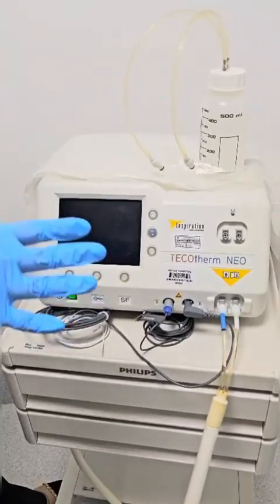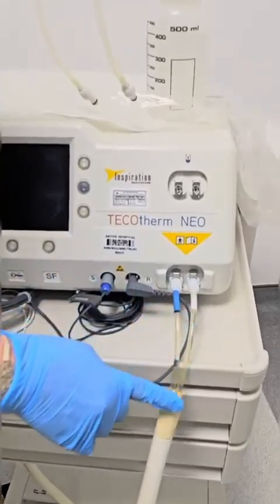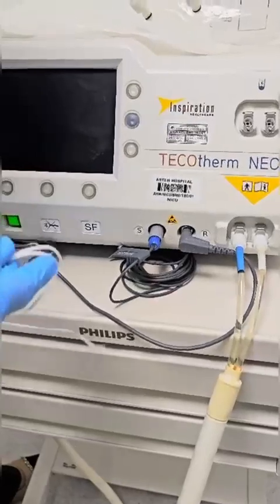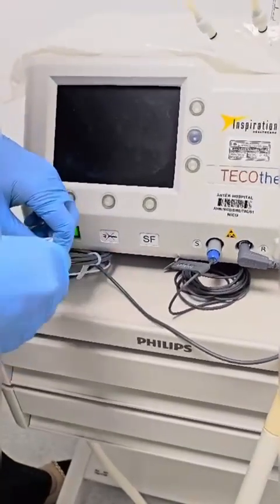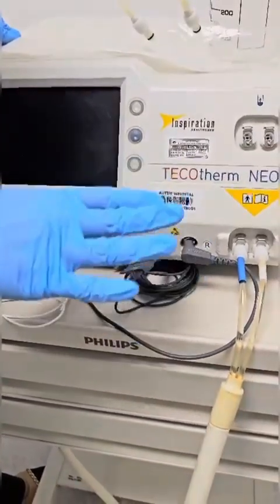What do we need to grab before we head to the treatment? We need to make sure that the thermal hose is available, rectal temperature sensor and disposable rectal sensor is available. Skin temperature is recommended, not essential.